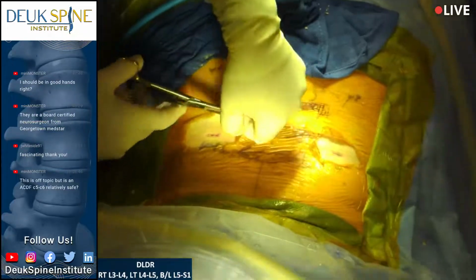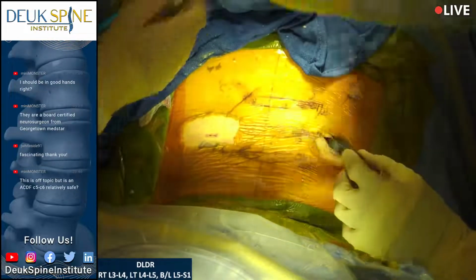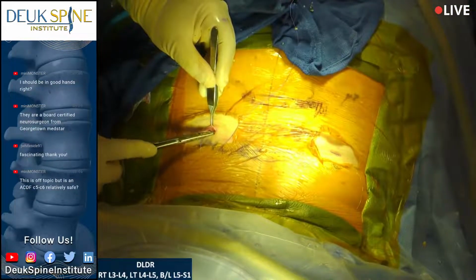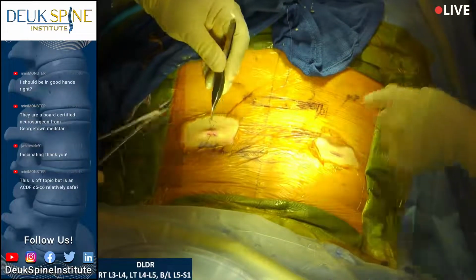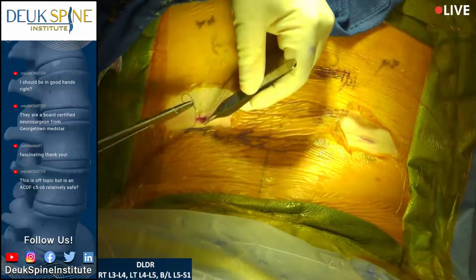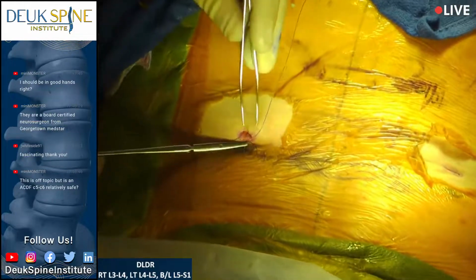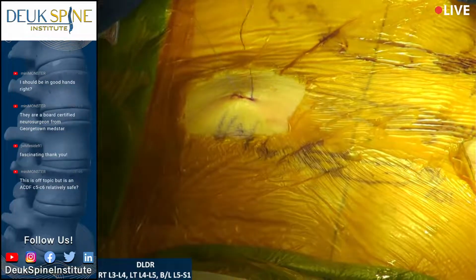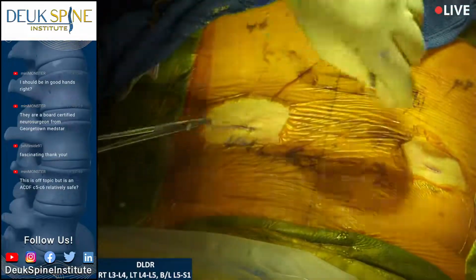I think somebody said defibrillator, right? So you know it's a, look, Luis, it's a reverse. Yes, sir. It's inverted. Yeah. I just want to make sure that's what you're doing. So she's going to get one stitch and then we're going to put a little Band-Aid on there. And we're going to let her family take her home, recover. She's had a big surgery today.